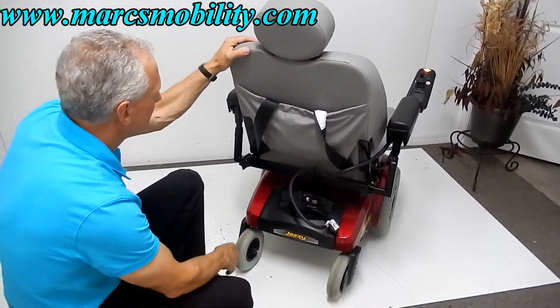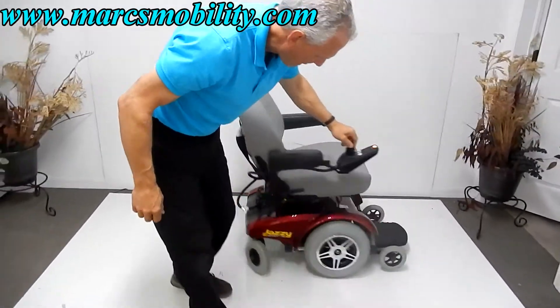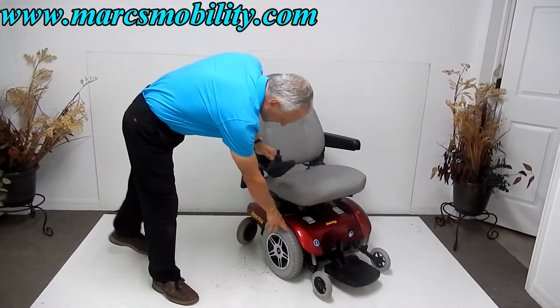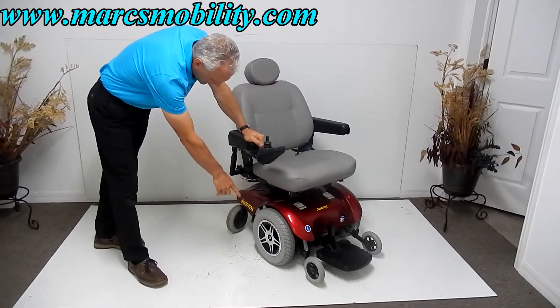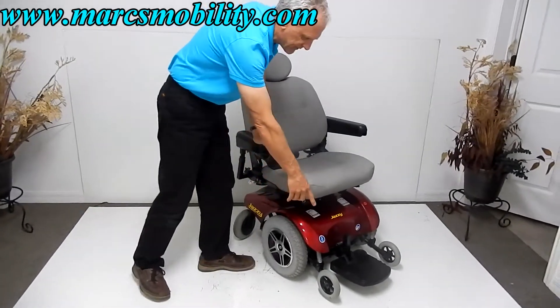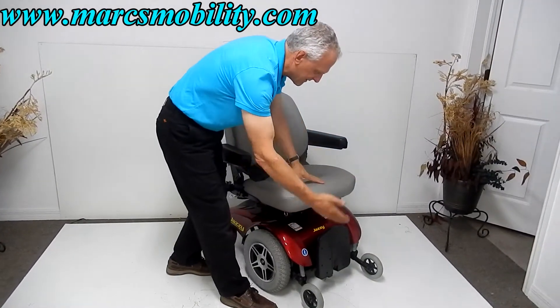You've got castor wheels in the back, a pouch right here, 14-inch drive wheels with non-skid tires and alloy rims, anti-tip wheels in front, and a foot plate for easy exit and entrance.